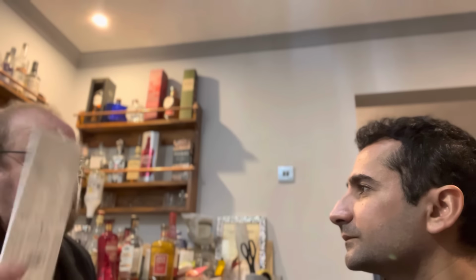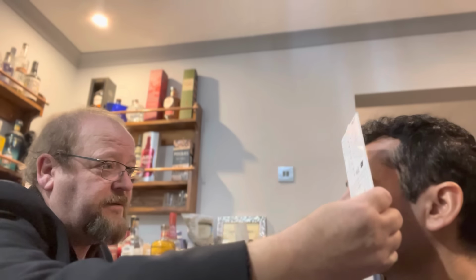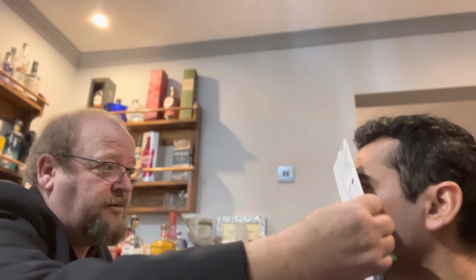The first thing I'm going to do, if you can just look at me, is what's called a cover test. First of all, I cover your left eye. As I move that away, I've got no movement at all. So I'll try that now, covering the right eye. Perfect. No phoria at all there.